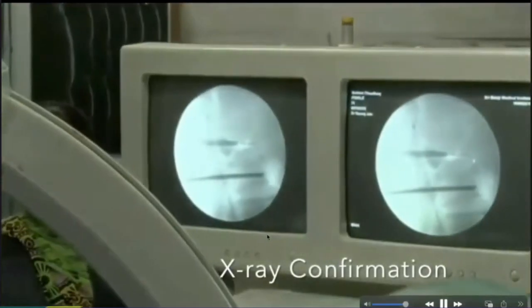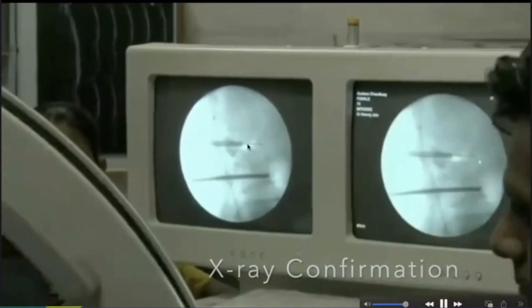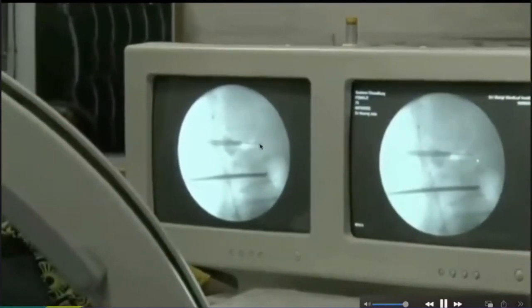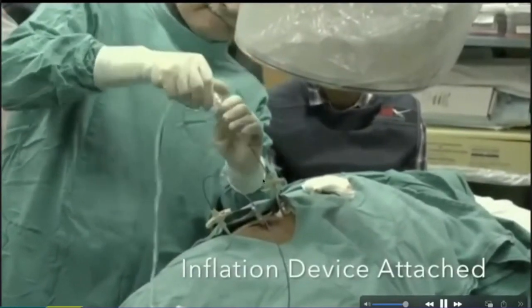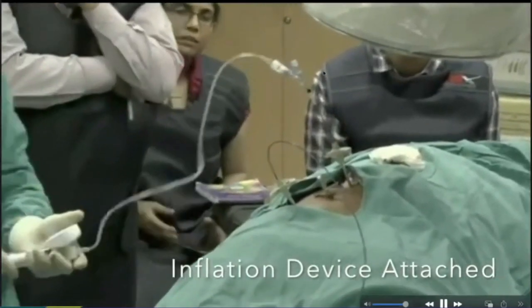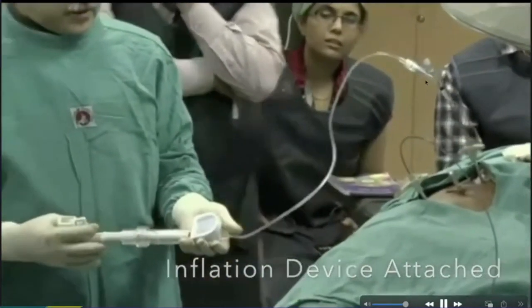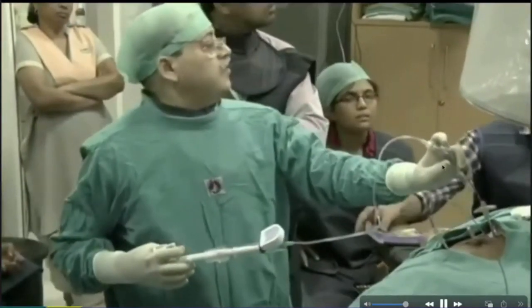This is where the balloon is, at the anterior margin. This is the balloon, right? Just 3-5 millimeters behind that. And then you start inflating, attach it well. And once you're trying to inflate, keep the balloon in place. Otherwise, the balloon starts moving front and back, or it tries to find the place of lower resistance. So it might go front or back, or might extrude. So please be very careful when you're trying to inflate the balloon.